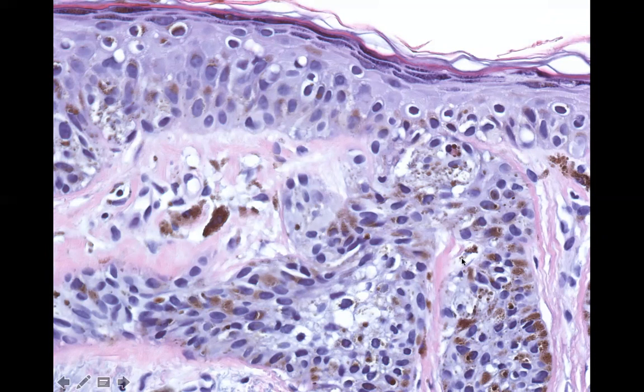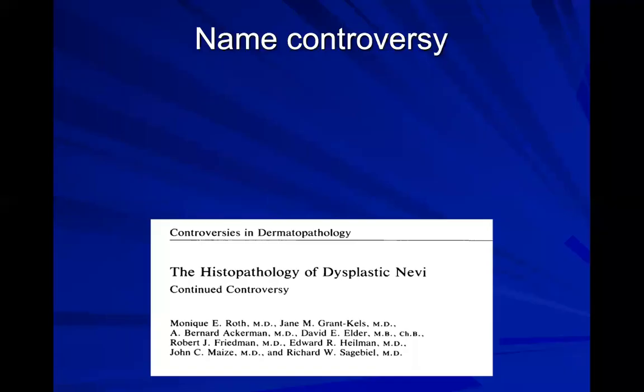And now your rete are kind of shaped funny because your melanocytes are shaped a little bit funny. So this one has atypia, but it shares that architecture of the bridging rete and lamellar fibroplasia. This is something that we might call a severely atypical dysplastic nevus. And those are truly dysplastic. The word dysplastic implies pre-malignant, right? And so these actually are probably an intermediate lesion on their way to melanoma.